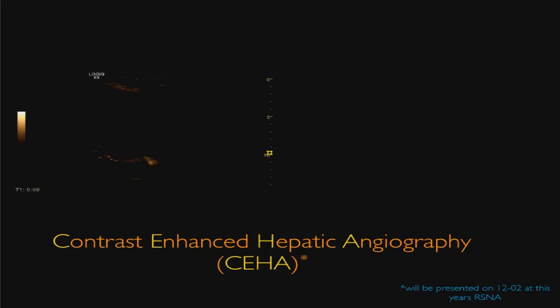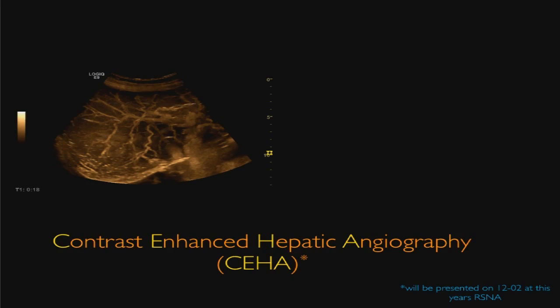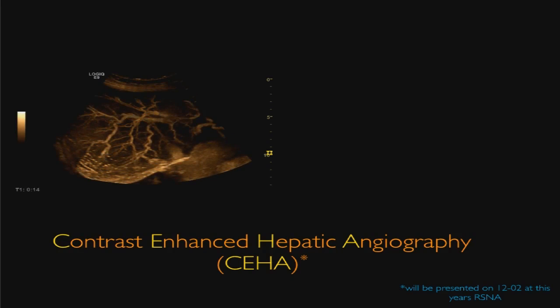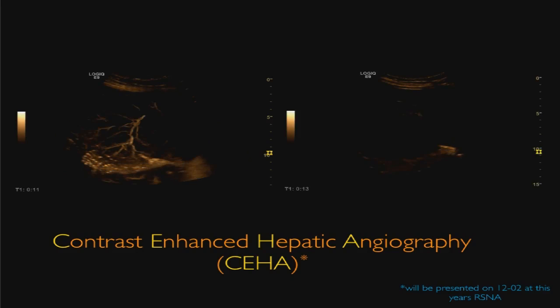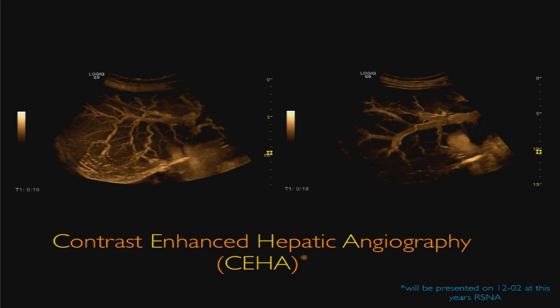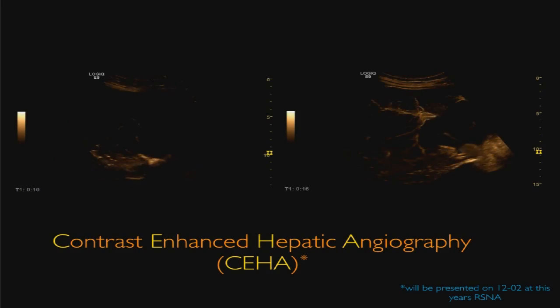This is important because we can use these time differences to image only the arterial system of the liver. This is a hepatic angiography of the right liver lobe, as you can see here. When we come 2 to 3 seconds later, we will catch not only the arteries, but also the portal venous system. But of course, the arteries have a higher concentration of bubbles, so they stand out much more clearly and are much more enhanced compared to the adjacent portal veins.